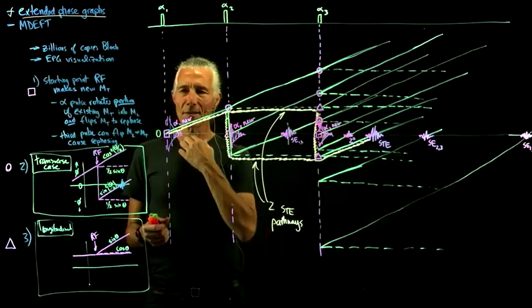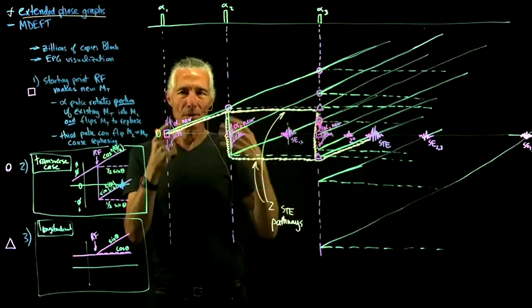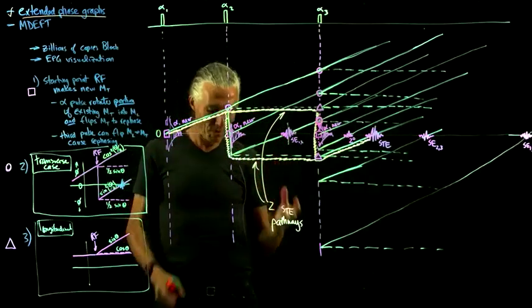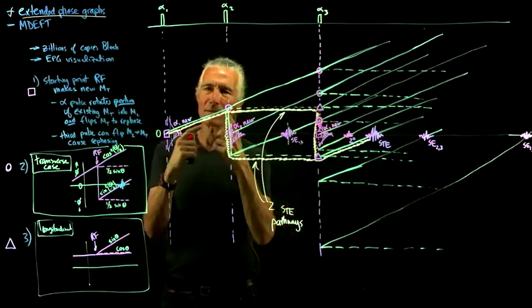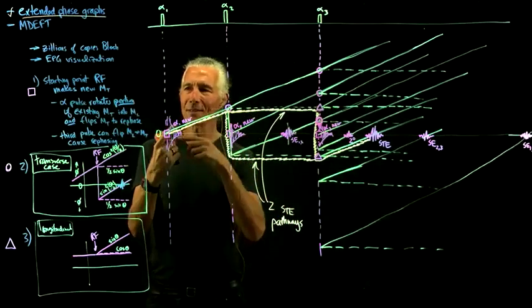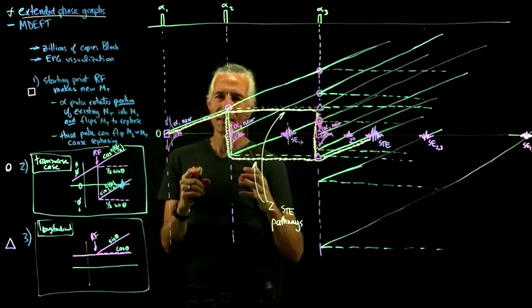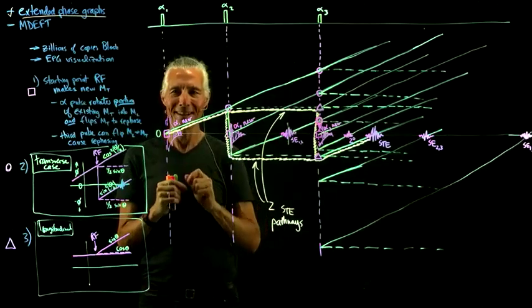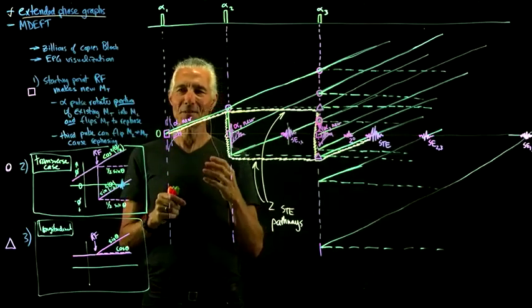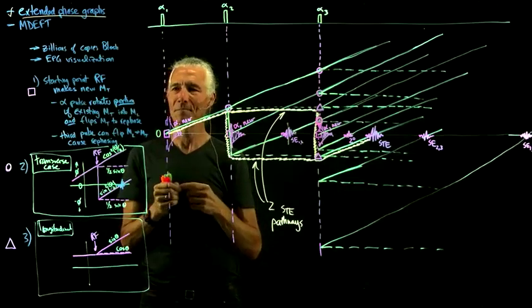Yeah, and like I said, you would normally do this with software to make the graphs. But what's the point? You've got this complicated thing with 3D vectors moving all around, and then you've got thousands of copies of them. You're just trying to reduce it. What's the goal? Reduce it to a 2-dimensional graph that a human can look at like a picture. That's really what the goal of this is.